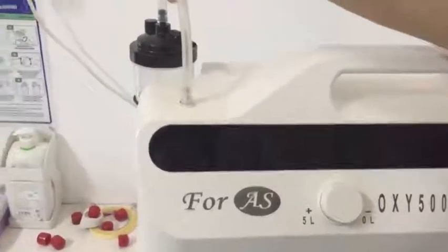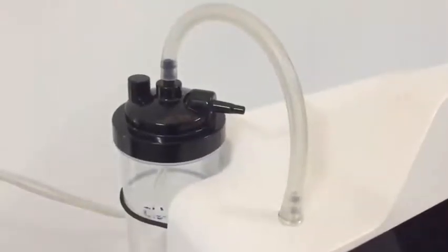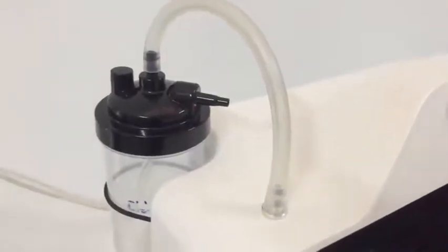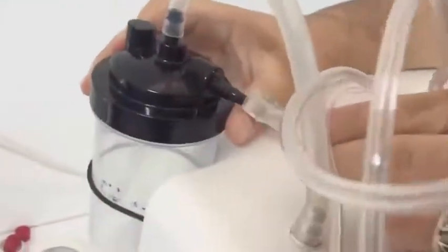After that, you must connect the oxygen pipe to the oxygen exit of the oxygen concentrator. Then you must connect the cannula to the connection points of the pipe, and the patient is going to breathe through it.